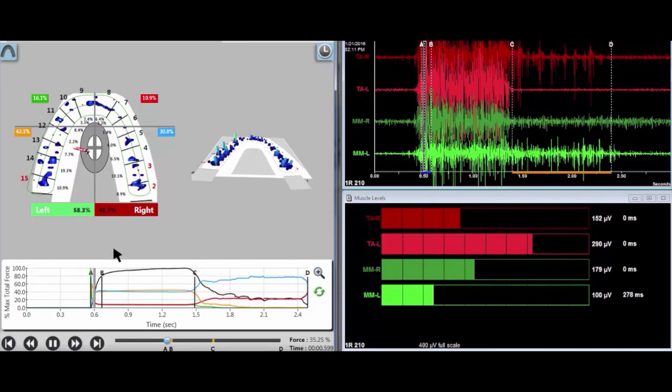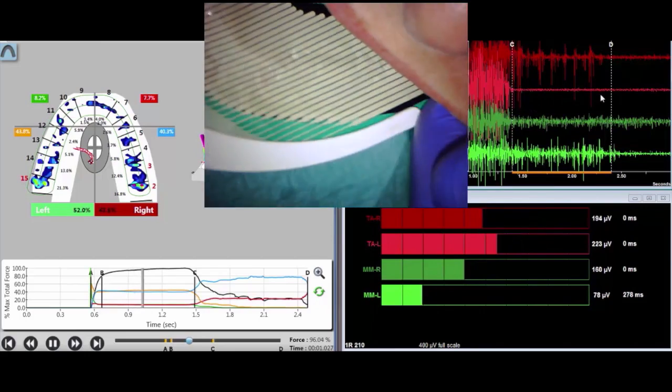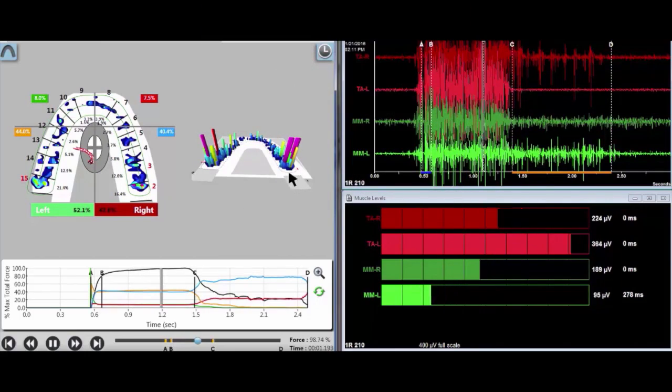An example of a right excursion. The center of force icon, the kite, shows graphically in a given instant where the average forces are in the arch, provided that the operator properly places the TSCAN sensor between the 2 central incisors. Notice the center of force icon not moving between the B and the C line.